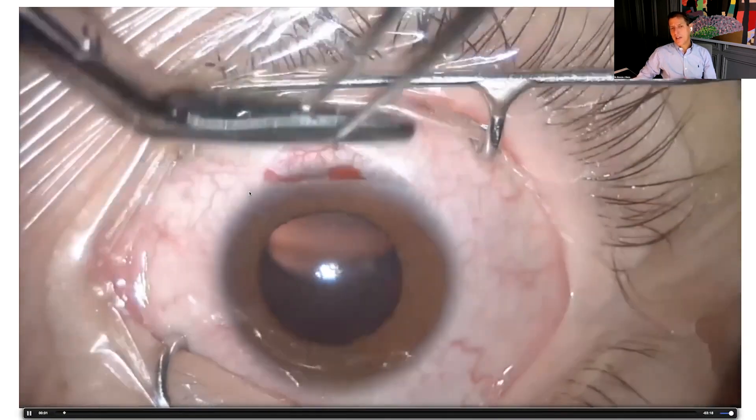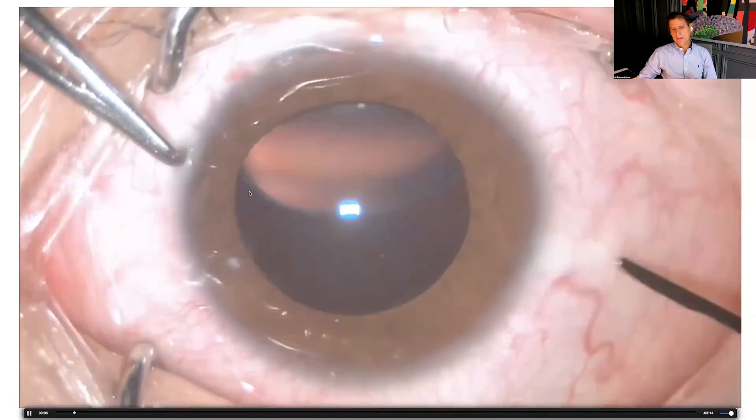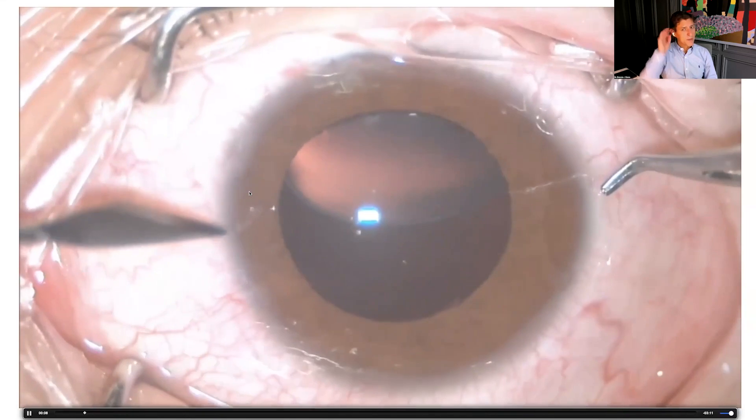It is also important to perform a peripheral iridectomy, since these are positive lenses — the optic can cause pupillary blockade. I learned this the hard way: in one case I didn't do an iridectomy because of the vault, then had an emergency pupillary blockade, and after that I always perform a peripheral iridectomy.